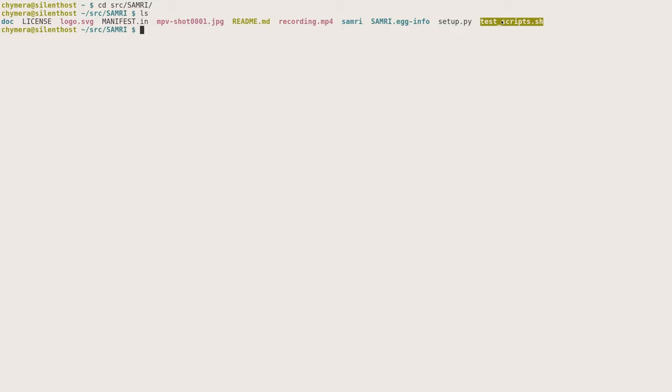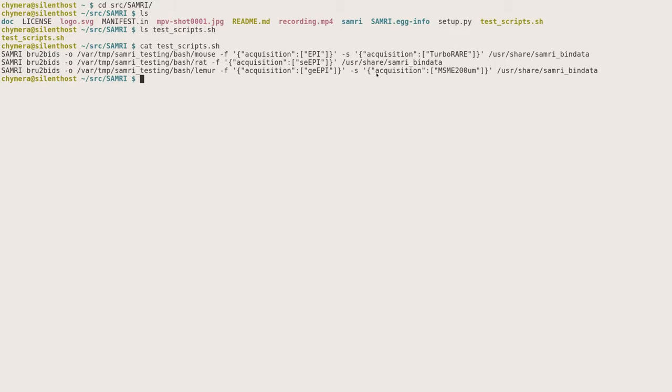If you look at the test scripts, you'll see there's a few of them, and all of them are currently demonstrating brew2bids. So you can just pick one, whichever one you want, and look at the parameters. You have "-o", this means the output directory, so the BIDS data will be generated into this directory.